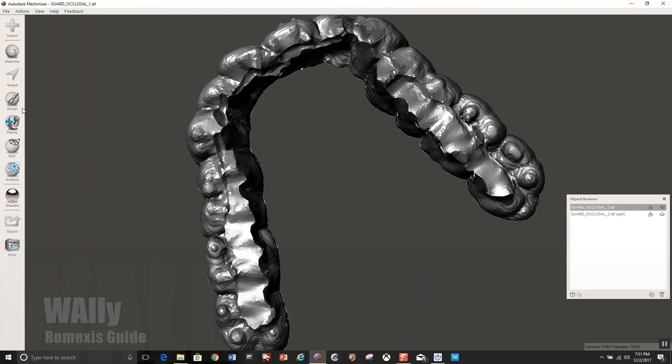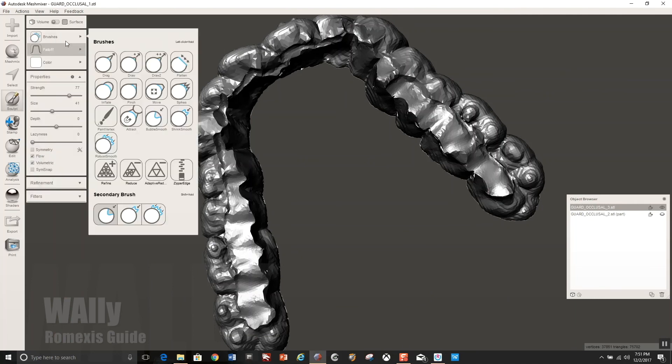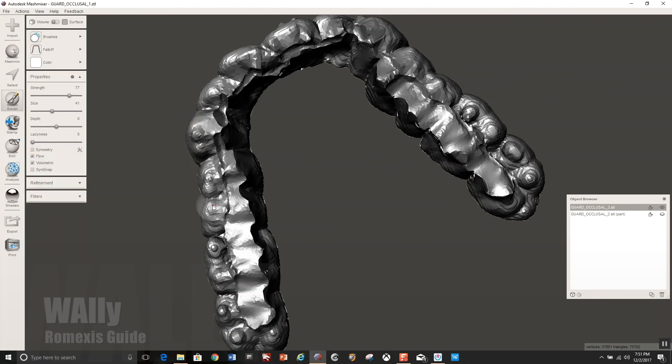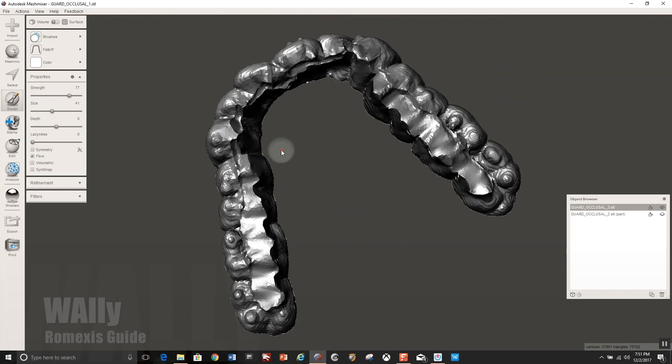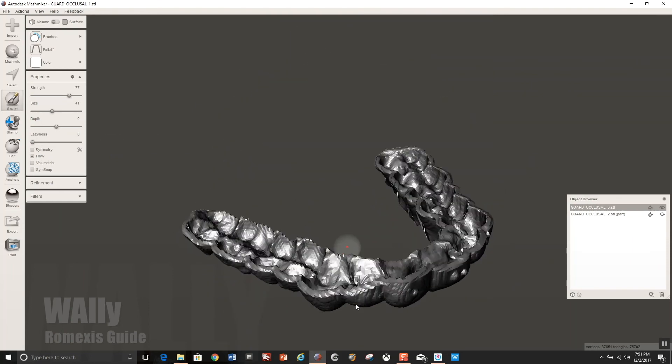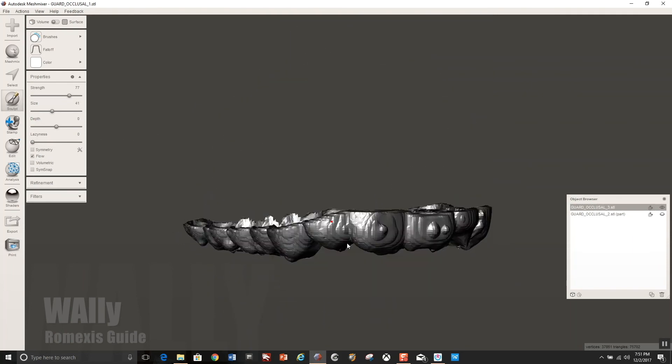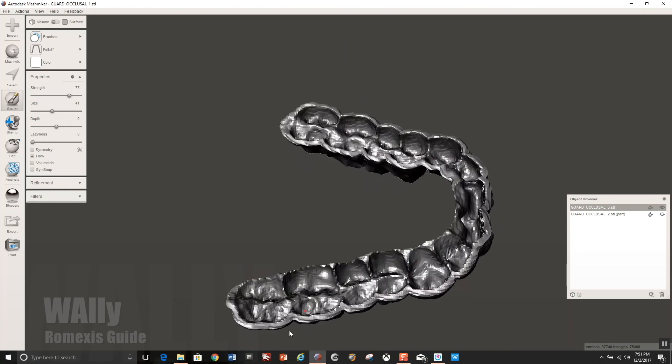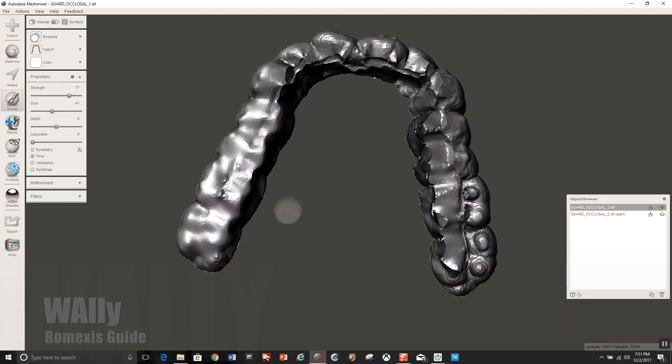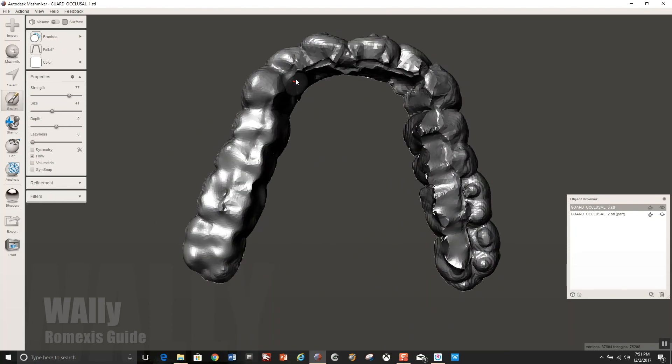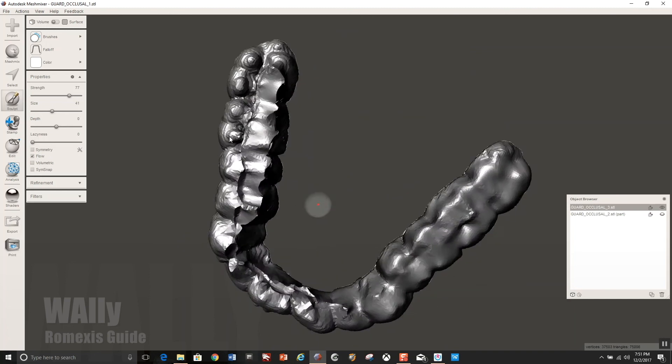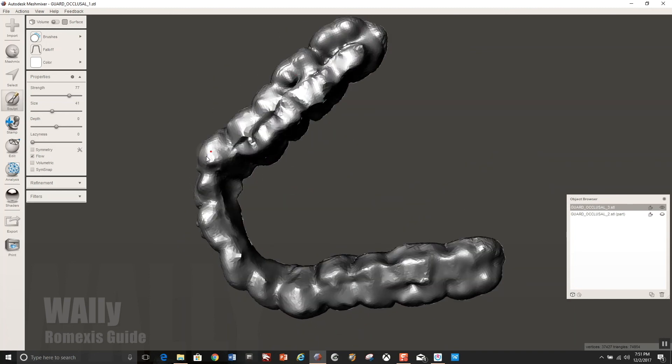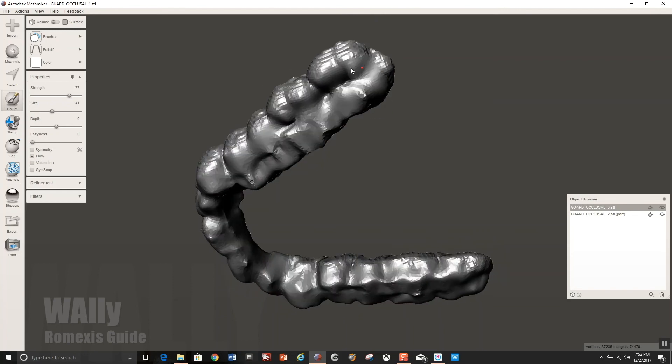You could stop here and then use a hand piece to smooth everything out, but I'm going to go ahead and just use robust smooth. Make sure volumetric is unselected once again, so you don't want it to go through. You're just going to, I'm just going to quickly round off being real careful not to mess with the divots too much that was created from the custom table that we just generated.